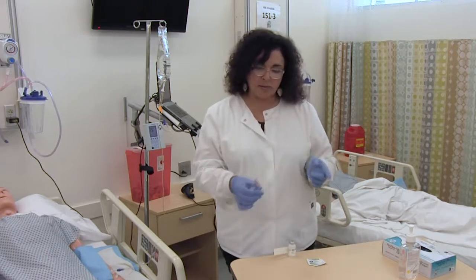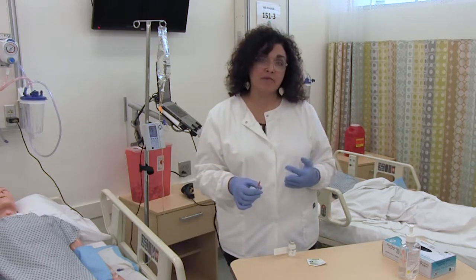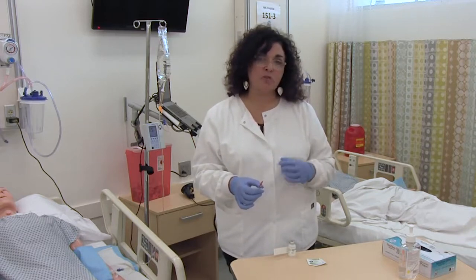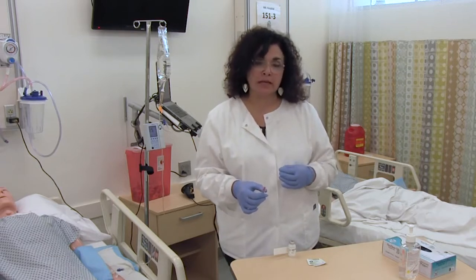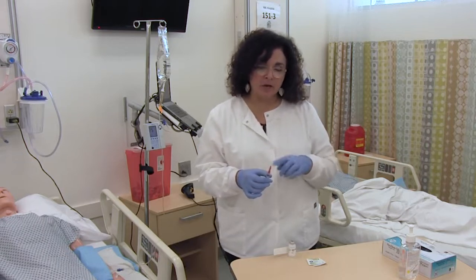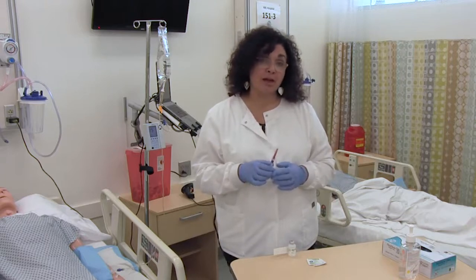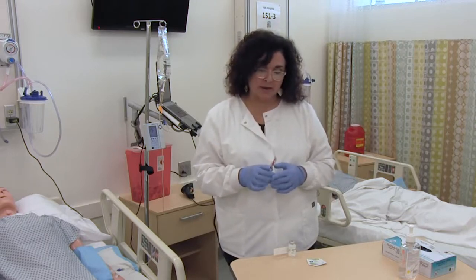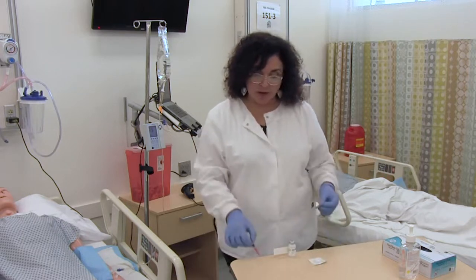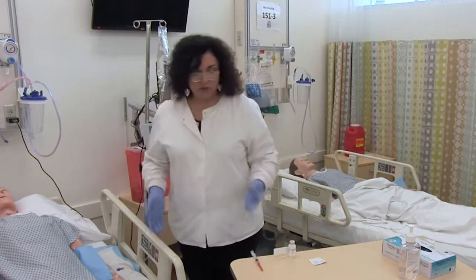So when I'm looking at the volume that I have to give, and then considering the safe time over which to give it, I like to divide up my volume so I know how much I want to give incrementally. So if I give a small amount every 15 seconds, I know with 1 milliliter volume, I will give about 1/4 of a milliliter every 15 seconds. Okay, so I have a game plan. I know how much I'm going to push incrementally. So now I'm ready to go ahead and administer my Toradol.